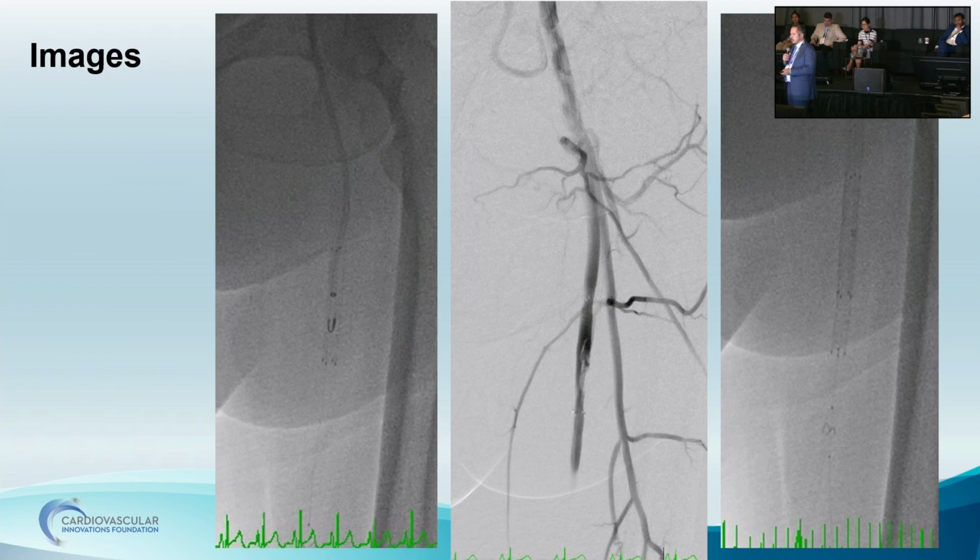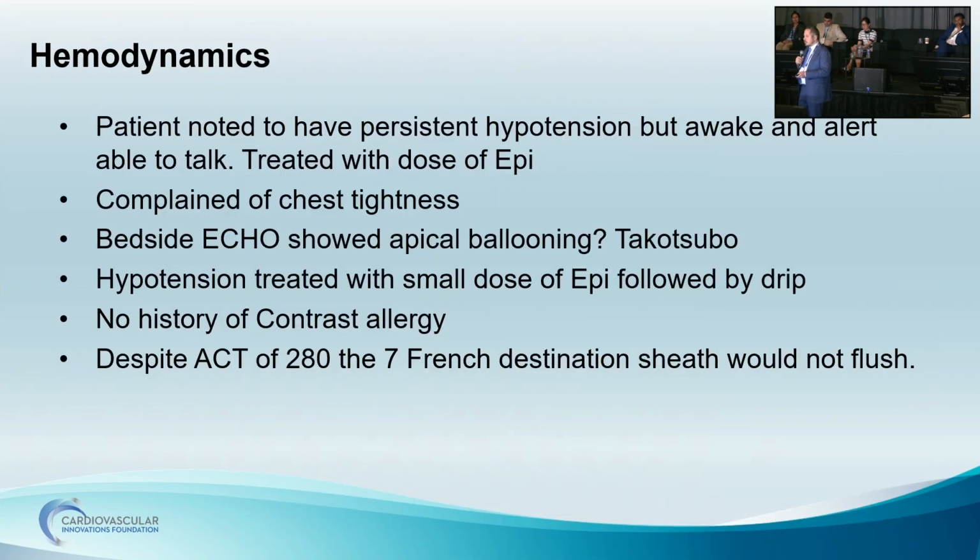Here's one thing I always tell our fellows: when a complication happens, it's just a series of complications. It's just a nidus for more complications. Unfortunately, this patient started having severe pain, then became tachycardic, tachypneic, hypoxic, hypotensive, you name it. They started having ST elevation across the EKG. That's a nightmare, right? So the question is, what happens?